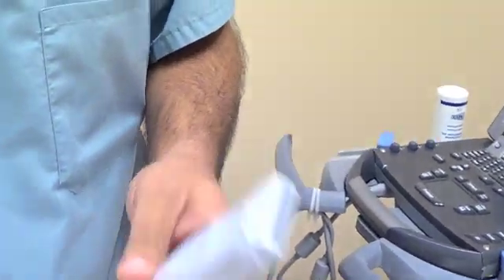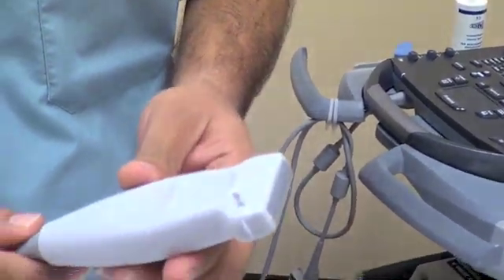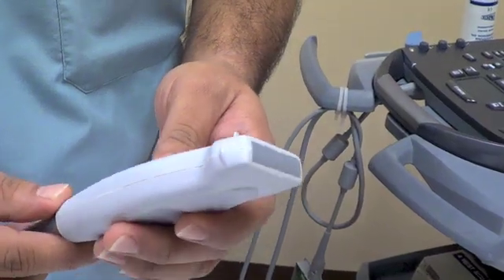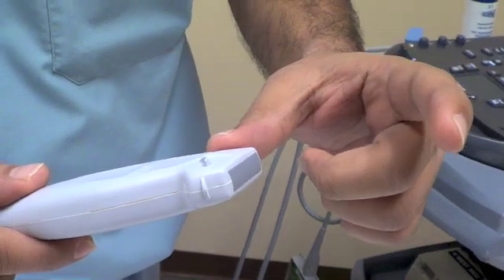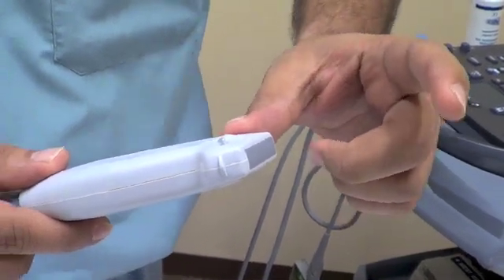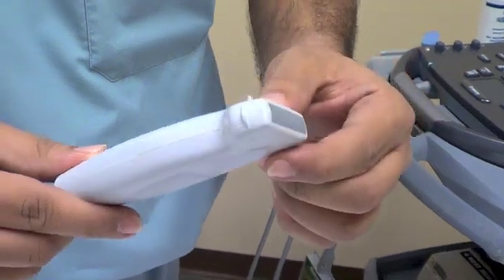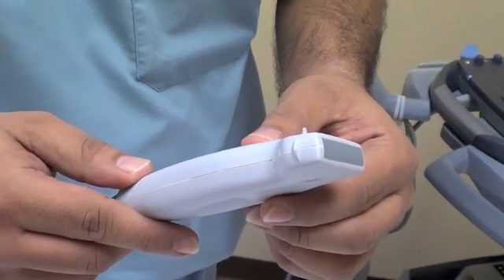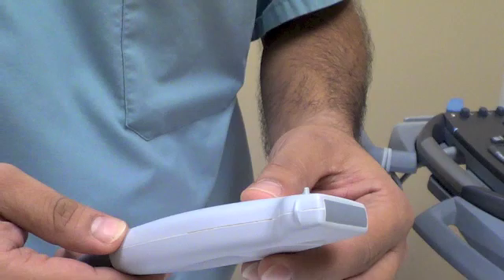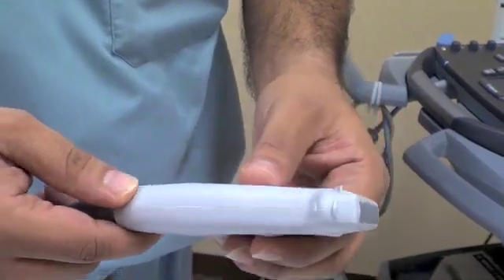We'll talk about the flat probe first. This is called a vascular probe, or a linear array probe. It's a high-frequency probe that generally only transmits ultrasound to about this depth, and that's why it's good for vascular procedures and superficial soft tissue — looking for abscesses, cellulitis, or a DVT.